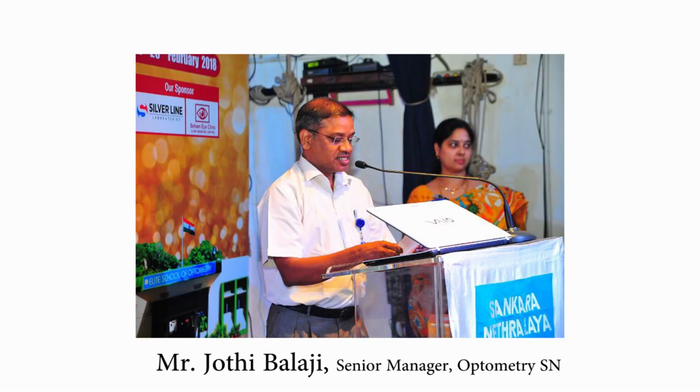Acknowledgements. Thank you, everyone. You would have done a lot of OCTs. You've gone through a lot of different versions of OCTs also. Yes, right, sir? Your experience. Maybe this is worthwhile to share.